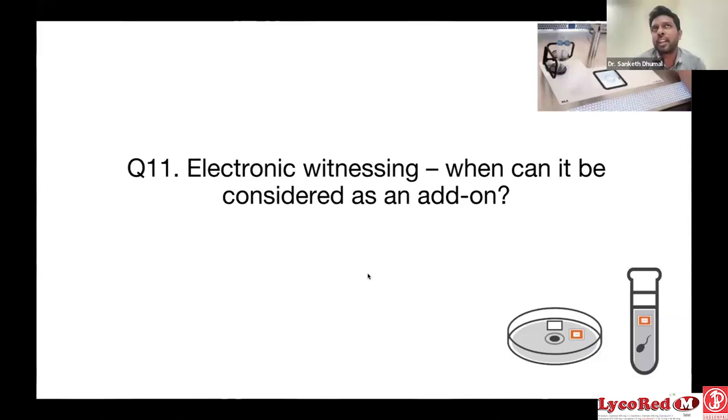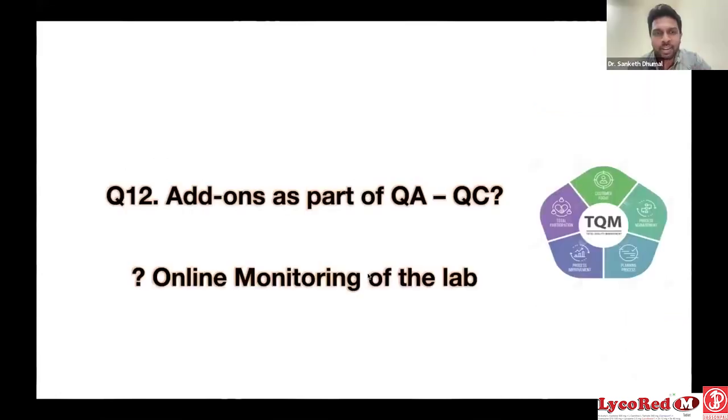See, it is like this, as you rightly said, when you have a 6x2 lab with two stereo microscopes, one can be used for witnessing and the other for manual work. It is up to you. It is customizable, right? Yes. Again, a lot of other questions.